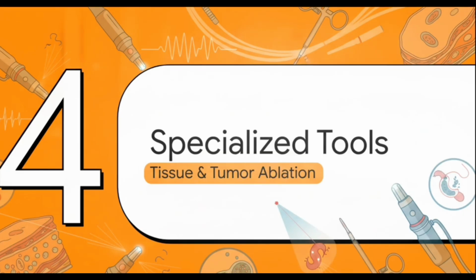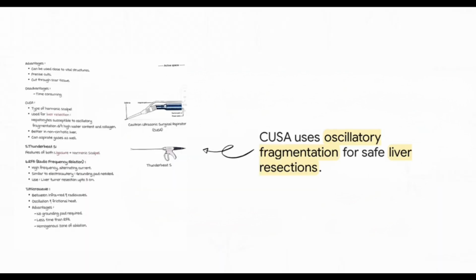Section 4, Specialized Surgical Tools. Let's talk tissue and tumor ablation. Check this out. This is CUSA, the Cavitron Ultrasonic Surgical Aspirator. Think of it as essentially a highly specialized harmonic scalpel that also acts like a vacuum to suck fluid and debris away simultaneously. Examiners love asking about its specific indication.